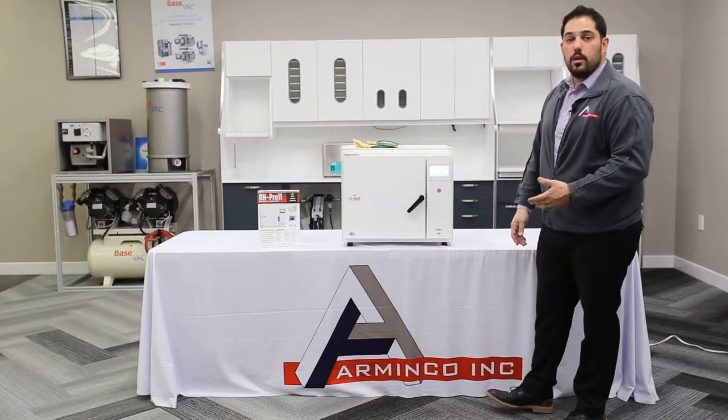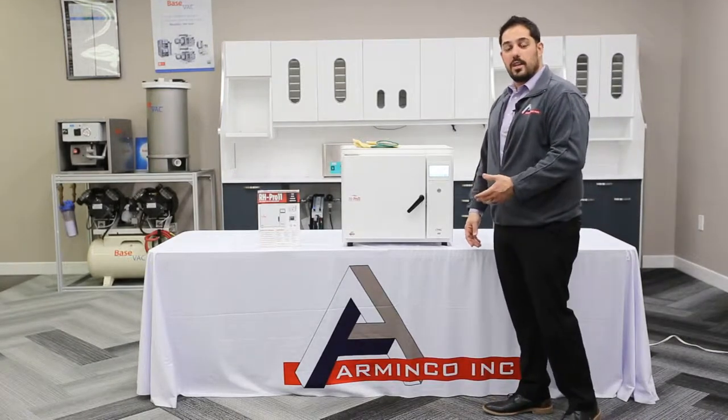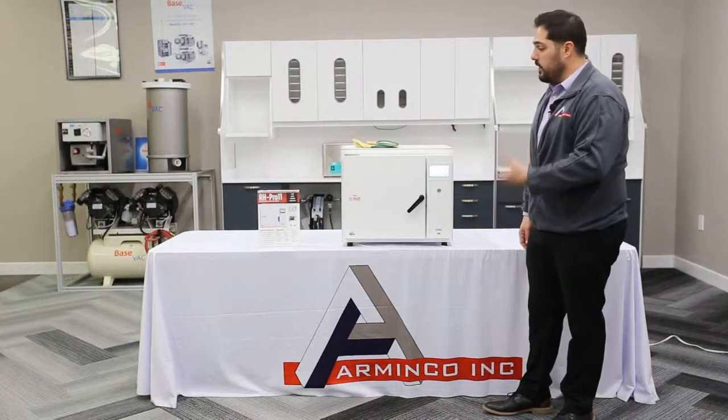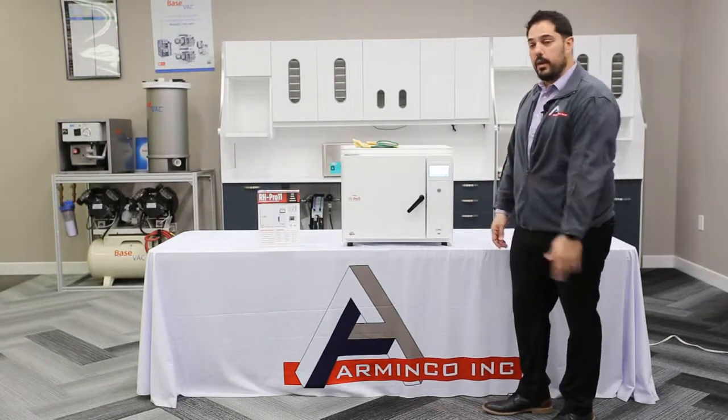This is a new product and a new unit that's going to revolutionize sterilization in any doctor's office, dental office, or any sort of office that needs equipment sterilized on a daily basis.